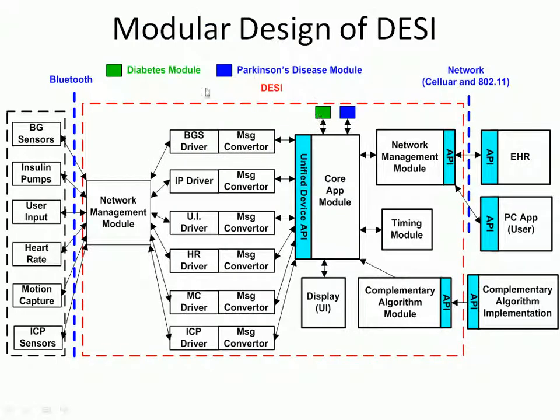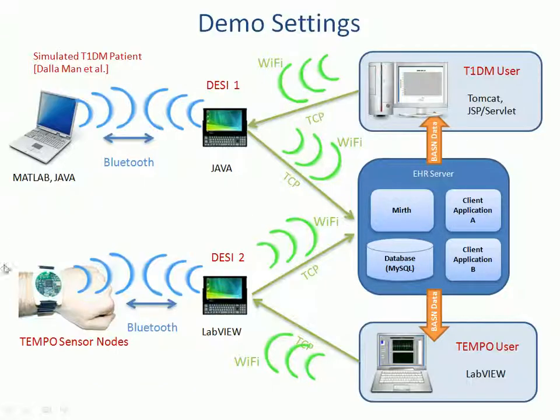Here is just the modular design of DESI, and just to mention that I am working on this type 1 diabetes case study, and my partner is actually working on the Parkinson's disease case study, and this is the accelerometer sensor. Next, I'm going to show you the demo.